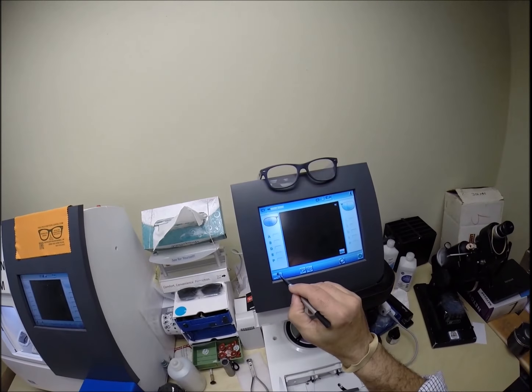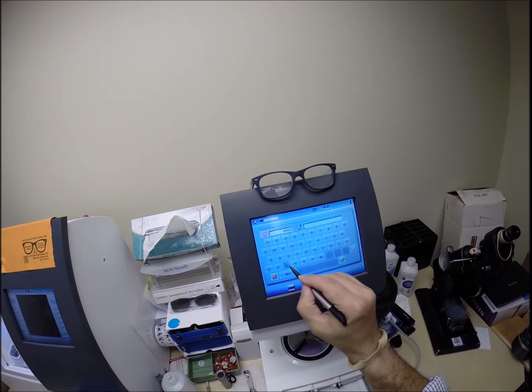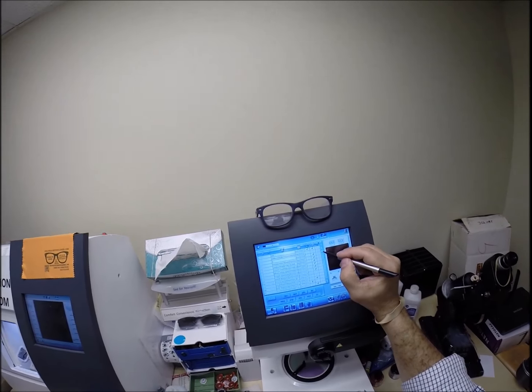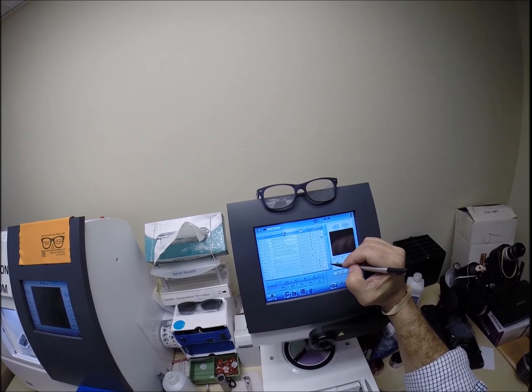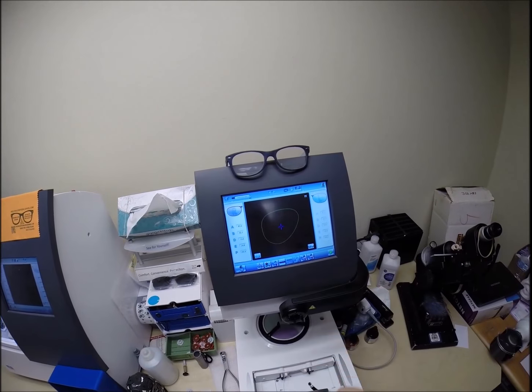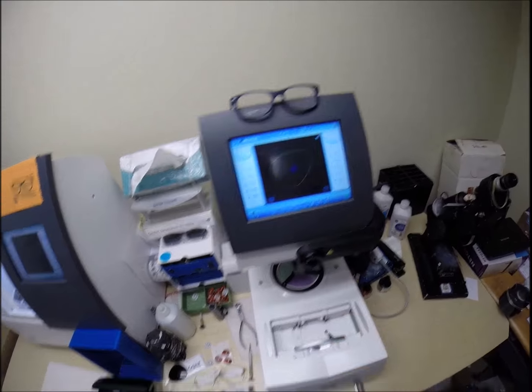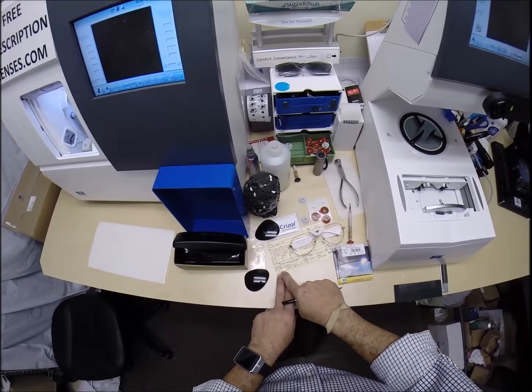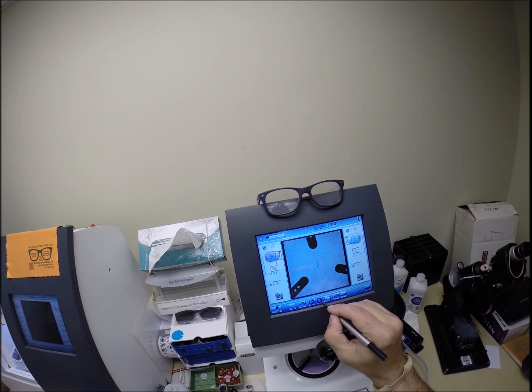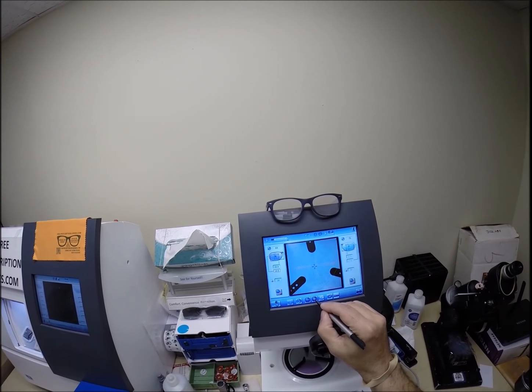So I have programmed this into the computer. Let me just search for this. This is the Versace 2150. Search. And actually it's going to be here at the very bottom. The 2150Q. That is it. That is the shape that we'll be cutting. That is the shape of the lens. That green outline, I'm going to move it on to the next screen. Your pupillary distance is 71 divided by 2 is 35.5. So I'm going to tap that in there, 35.5. And we'll move the optical center height up in just a moment. We're going to see how that works.